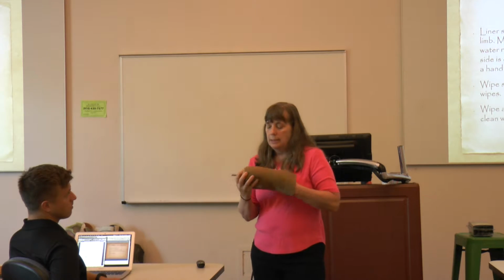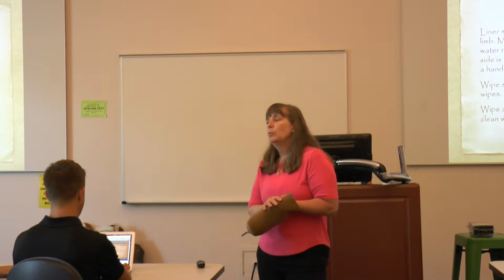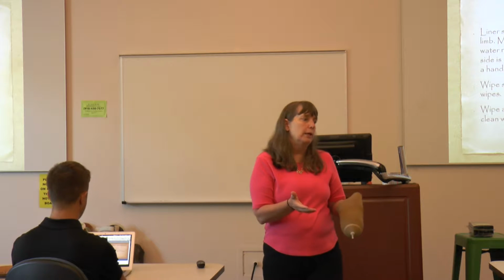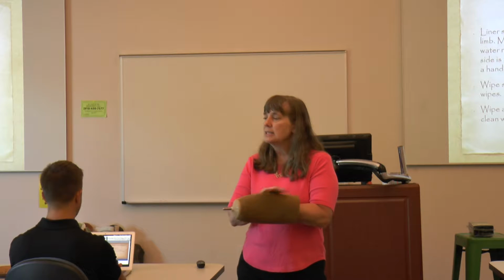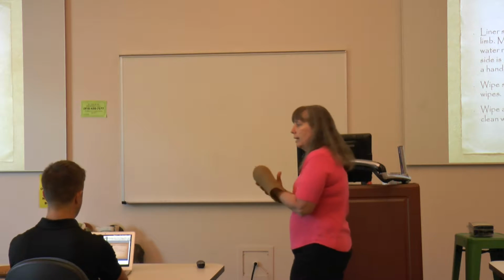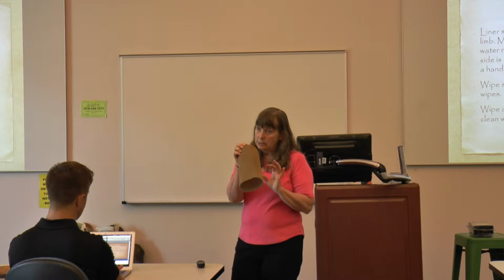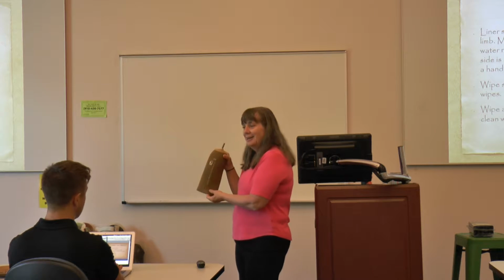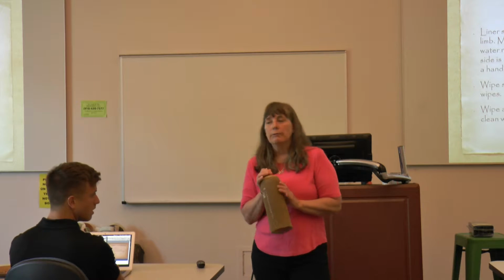Once a week, I recommend that they clean the cloth side. Clean it like you would a hand wash shirt. Put a little Woolite in some cold water, or something similar. Woolite doesn't have to be brand name, guys. And water, and scrub this side and clean it just like you would a hand wash shirt. If you don't clean the outside, it gets stained, like this one that was donated to my cause, because I need to show you those things. Okay? That's my cause. You need to keep it up on a regular basis.